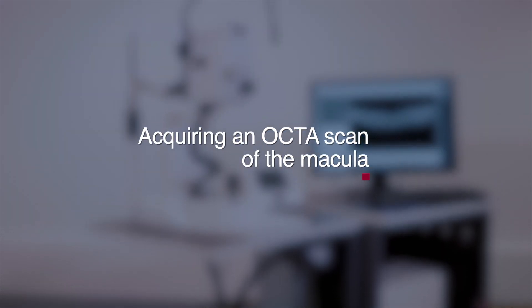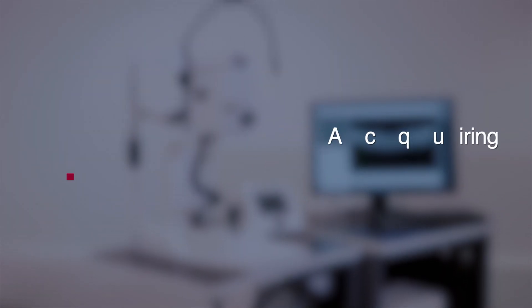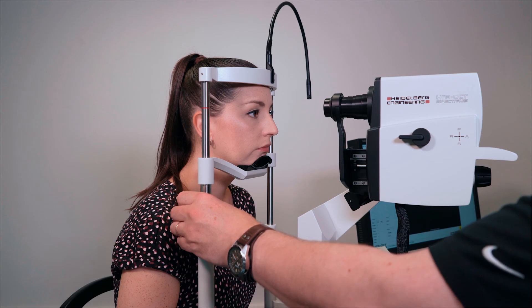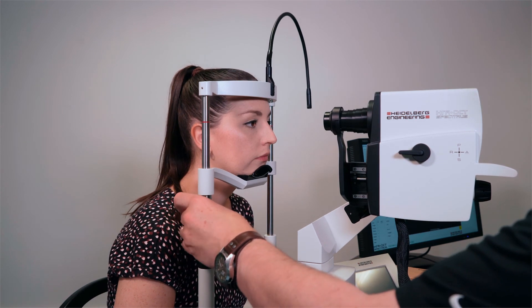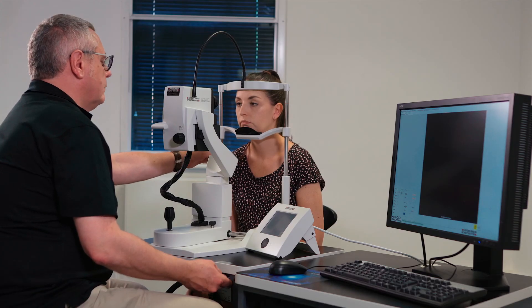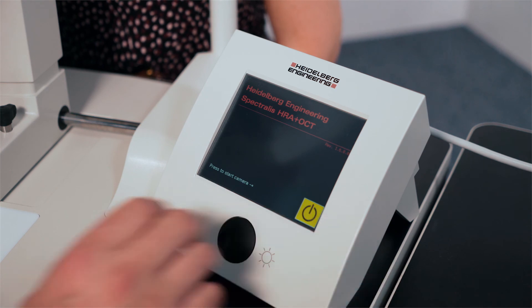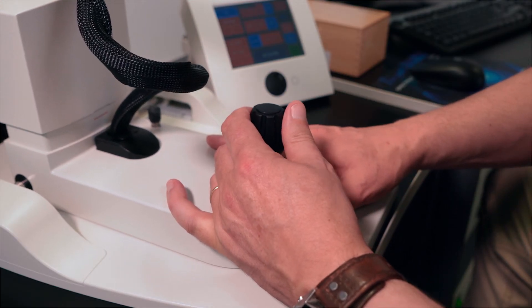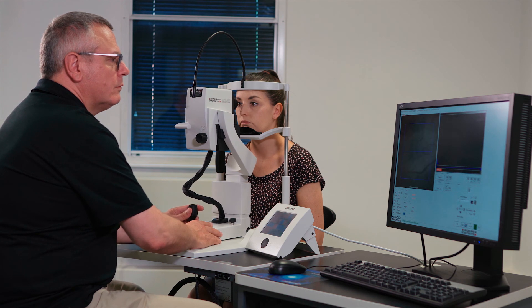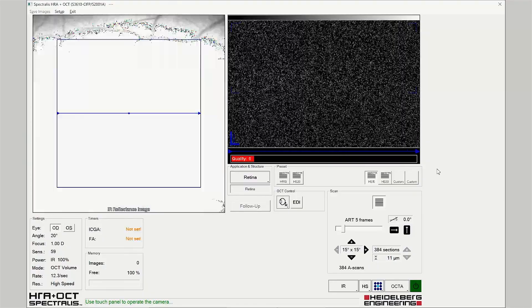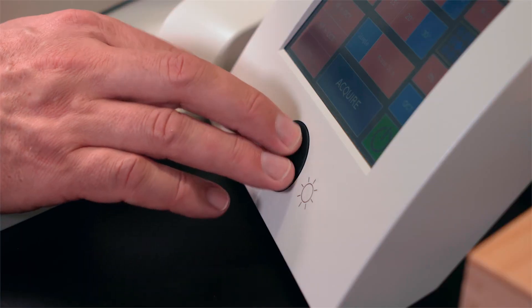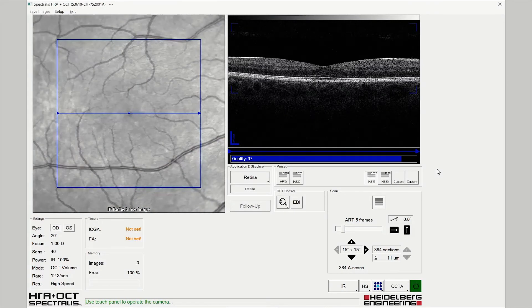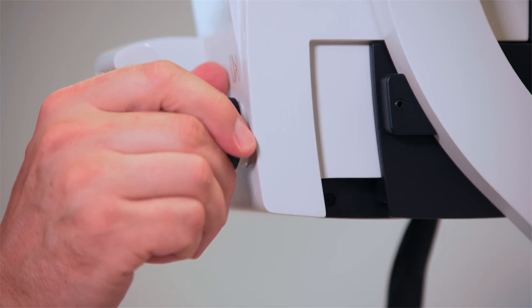Acquiring an OCT angiography scan pattern of the macula. Adjust the table height and headrest for optimum position and comfort. Start the acquisition module and align the Spectralis in the usual way, ensuring even fundus illumination and adjusting for brightness and correct focus.